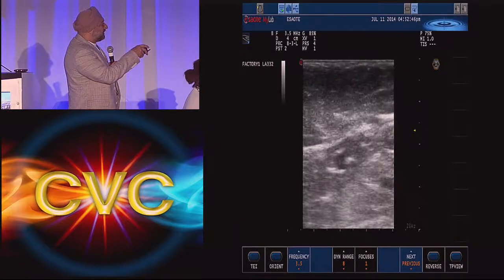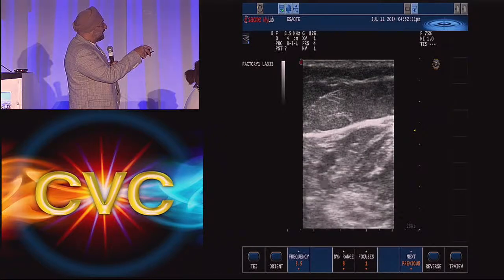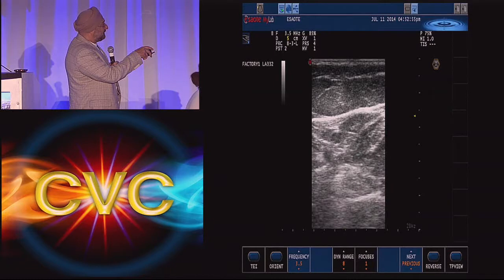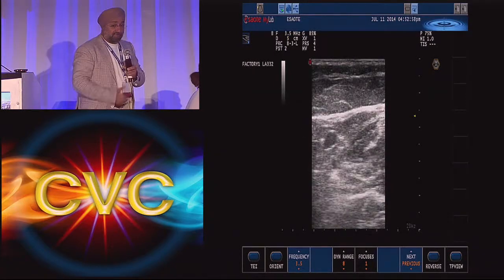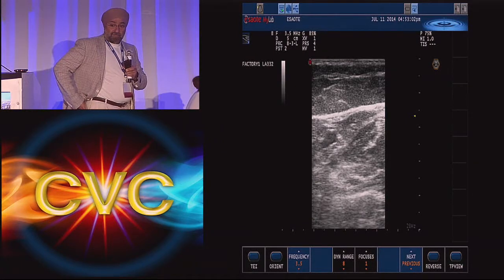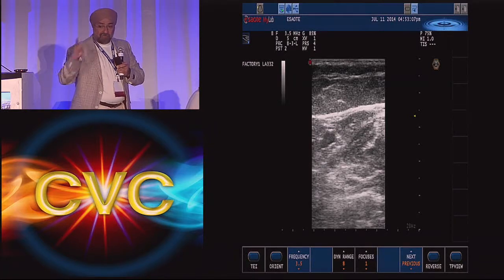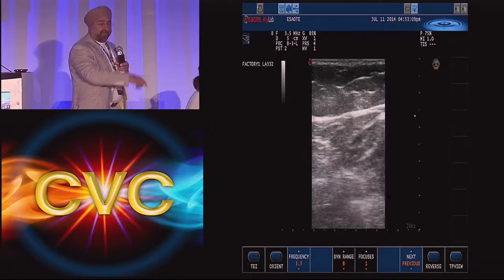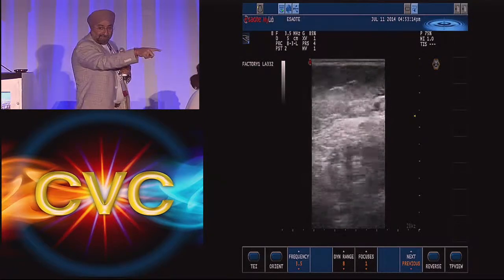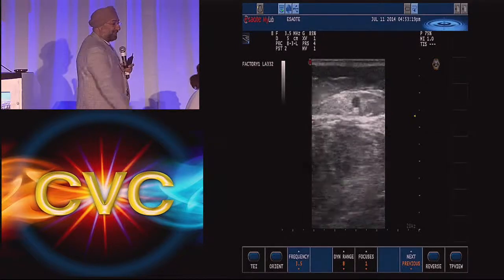And you can also see, can you go back for one second? I just saw a perforator right there. See that fellow going down? And you can see reflux there. So believe it or not, you'll see perforators that are refluxing from the lateral side of the thigh. I've seen them up from deeper, profunda branches as well, but the secret is, where's the problem? Chase it back. You talk to a forensic accountant, they'll tell you, follow the money. In this way, follow the blood flow, you'll find the problem.